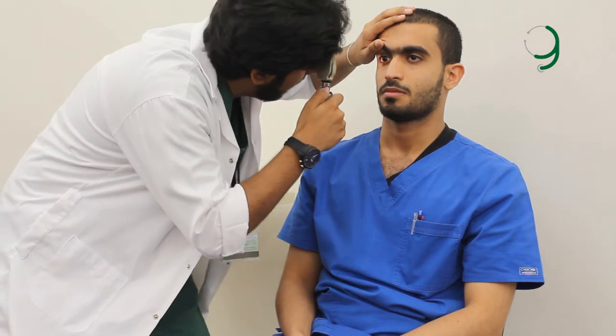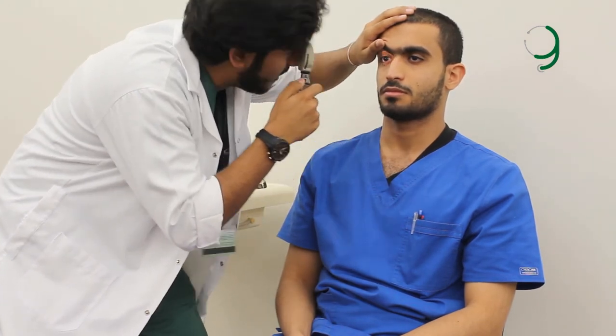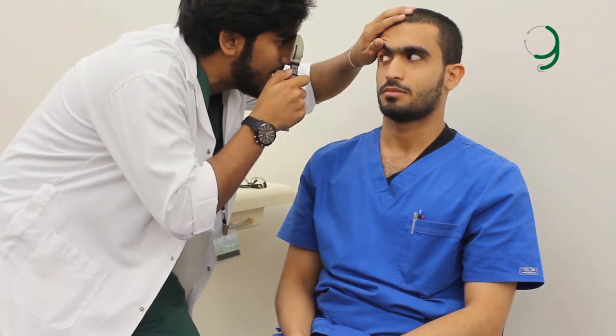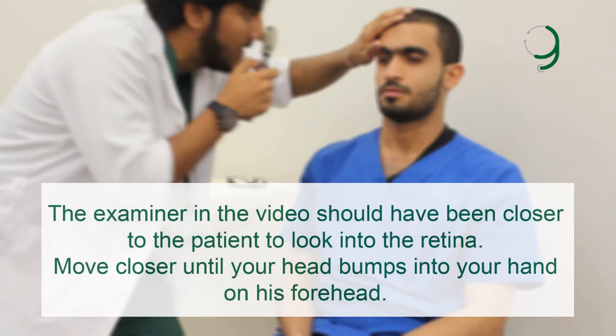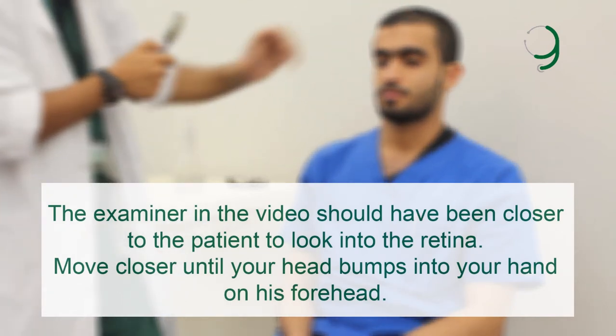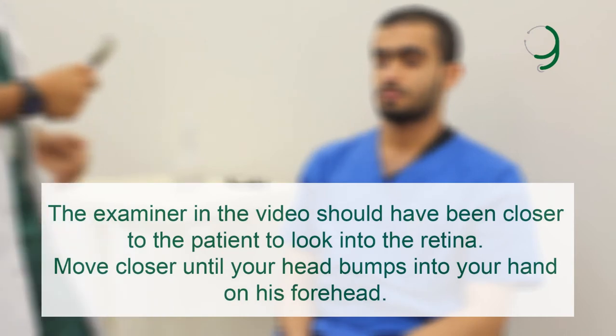Once you find the optic disc, you can look temporally to find the macula. Or you can ask the patient to look directly into the light. Can you please look into the light to assess the macula and fovea better? Next, you need to compare with the other eye — the right eye with the right hand and the left eye with the left hand.